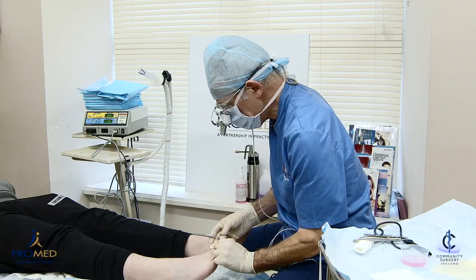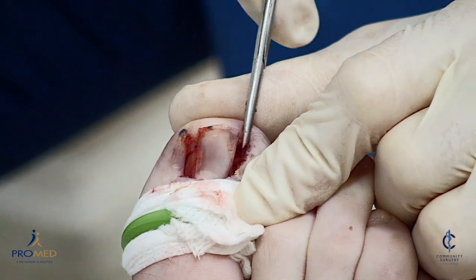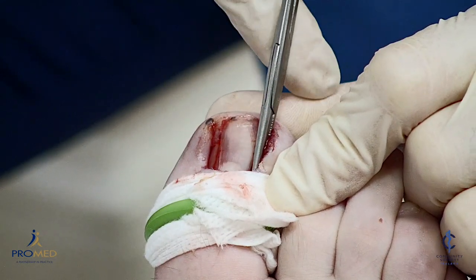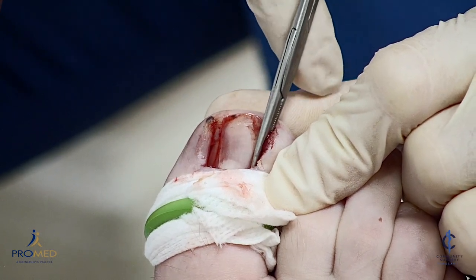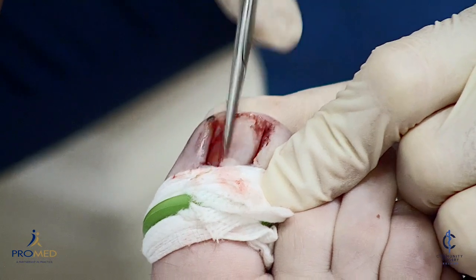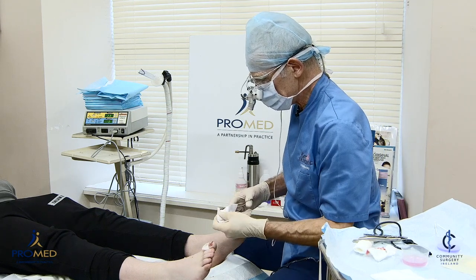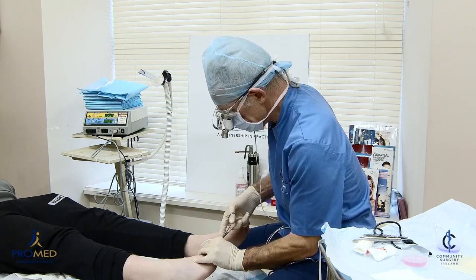We've finished removing the nail — we've left half the nail behind, taken out a quarter on each side. Now we want to destroy the nail bed to stop it from growing back in these two corners. There are two ways: one is to use phenol, which is the more traditional way, or you can use radiosurgery. Surgeons in hospital often cut out the nail bed surgically, but that's very traumatic — the patient's on crutches for a week, and it's no more successful than phenol or radiosurgery.